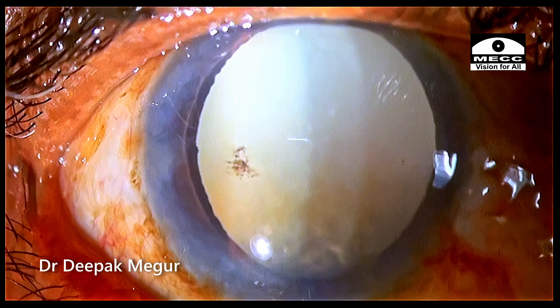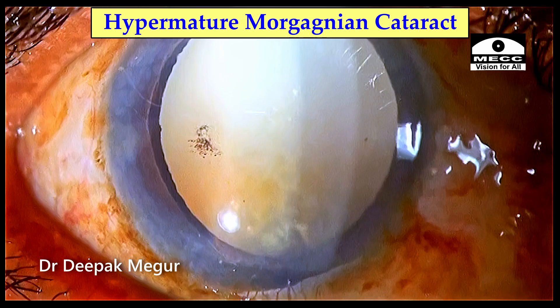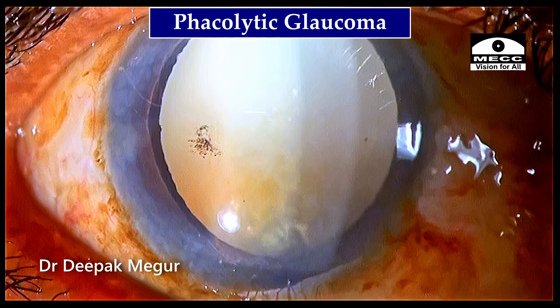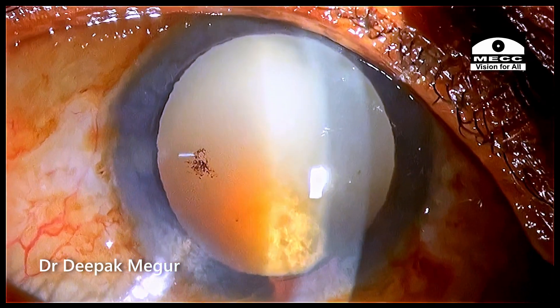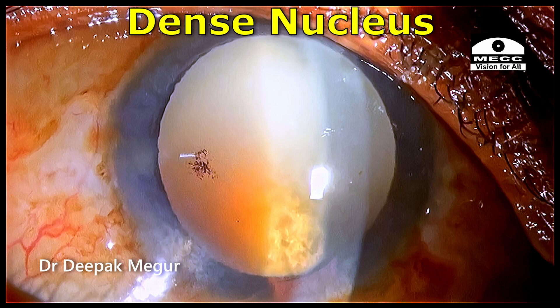This is an elderly lady who has hypermature Morgagnian cataract with phacolytic glaucoma. The slit lamp examination shows that the dense nucleus is sinking down in the bag.